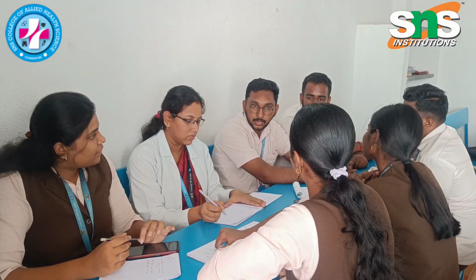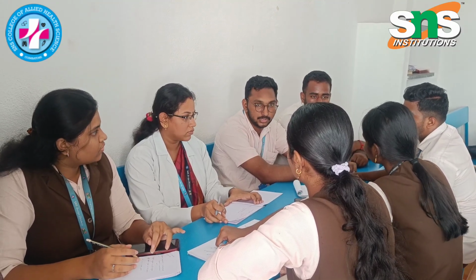Some common things should be present for both lung and heart retrieval. Those are 1 ml syringe, 2 ml syringe, 10 ml syringe, 20 ml syringe, and ABG syringe. Do you know the reason behind the ABG syringe? We can use a 1 ml or 2 ml syringe, but why do we have a separate ABG syringe? For ACT. Because the ABG syringe is heparin coated, so the blood will not be coagulated, and we have time for checking the ABG status.